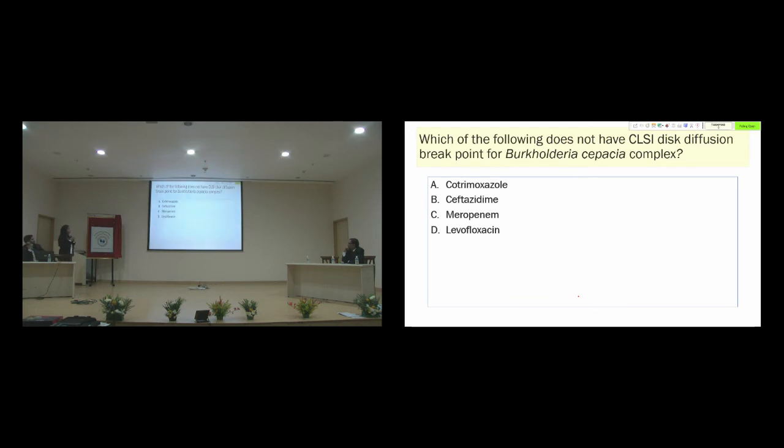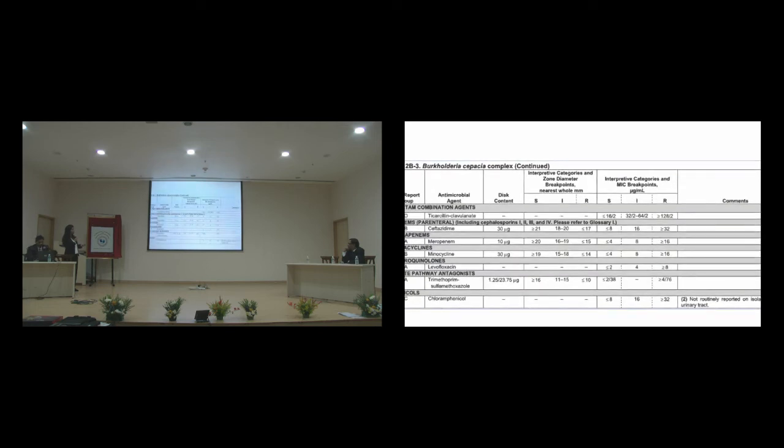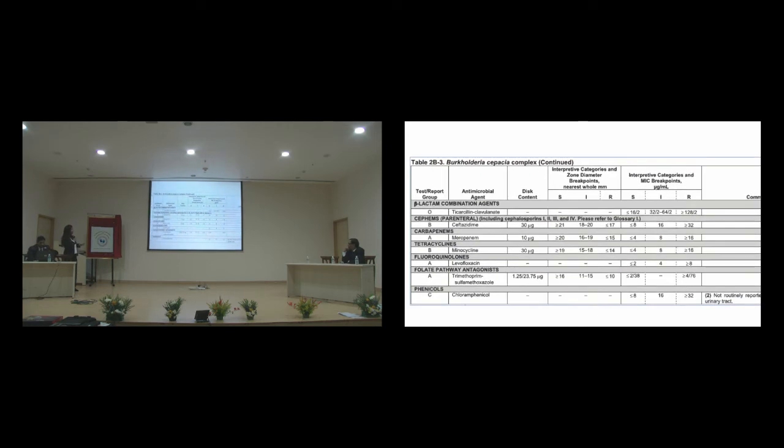Next is about, briefly about Burkholderia cepacia complex. So which of the following does not have a CLSI disc diffusion breakpoint for Burkholderia? Answer is levofloxacin. You can see in this picture, levofloxacin does not have a disc diffusion breakpoint. Only MIC interpretation criteria is available. So these are the drugs which CLSI recommends for testing for Burkholderia. Most commonly what we test is ceftazidime, meropenem, minocycline, levofloxacin, cotrimoxazole. This is what is a panel.